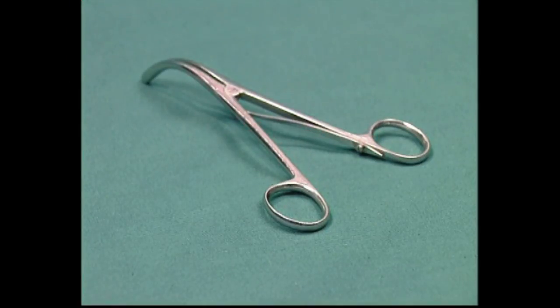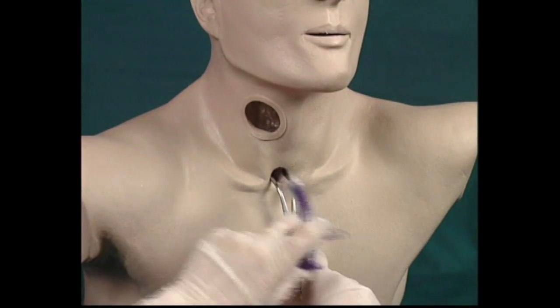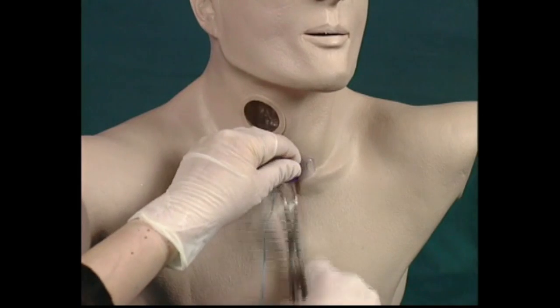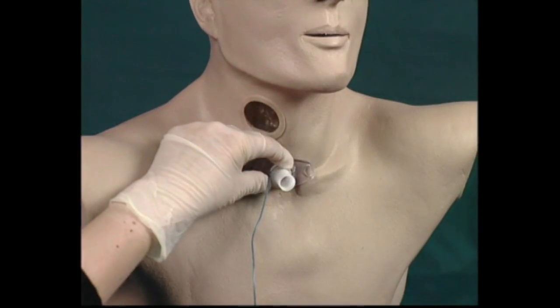Sterile tracheal dilators must always be available as there is the continual risk that a tube may fall out or become misplaced. They are useful at tube reinsertion as they allow the stoma to be held open for ease of guidance of the new tube.